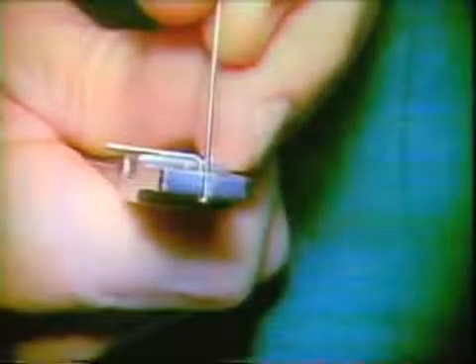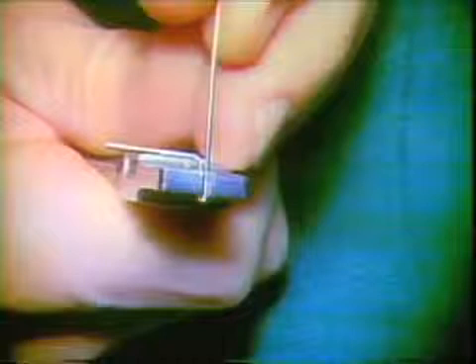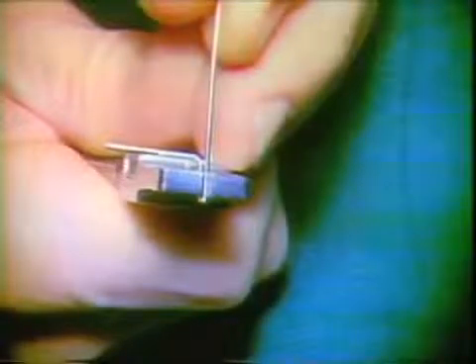This shows the plier in place folding and crimping the wire to be placed into the lingual sheath.